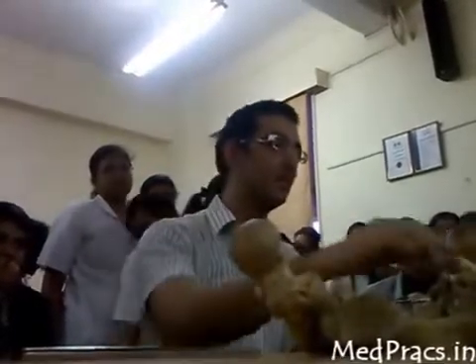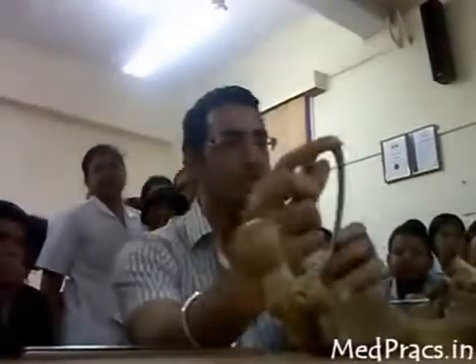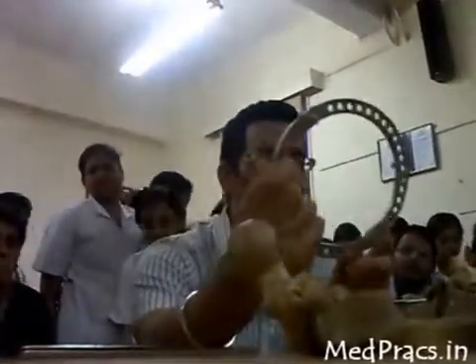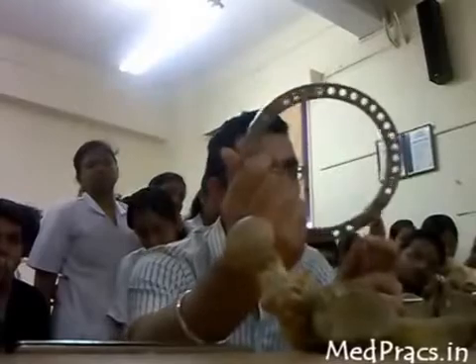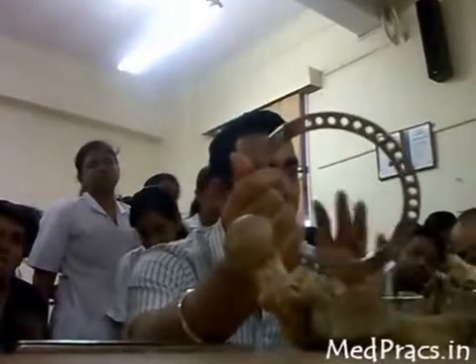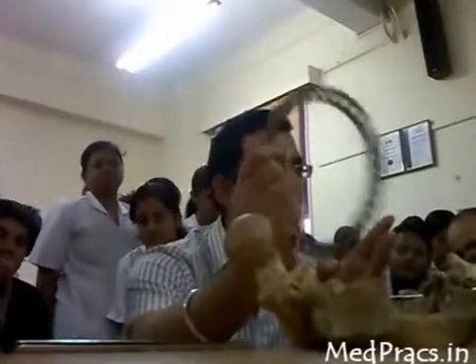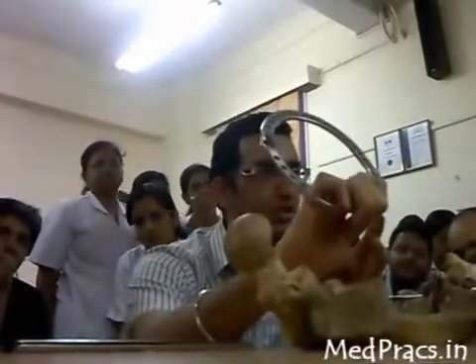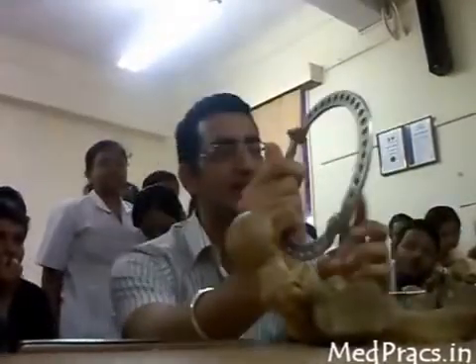This is a full ring Ilizarov fixator. Various sizes are available — 140, 120, 160, 180 — depending upon the circumference of the limb (leg or thigh). You must measure preoperatively and use the appropriate ring size. It is either a 3-ring or 4-ring fixation. The various types of external fixators are pin fixators and ring fixators.